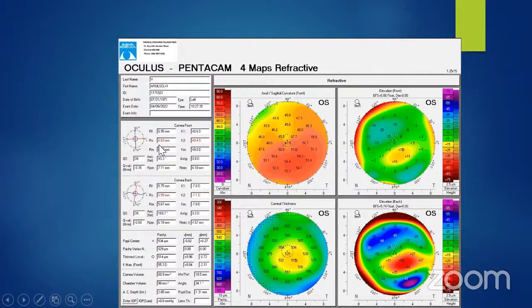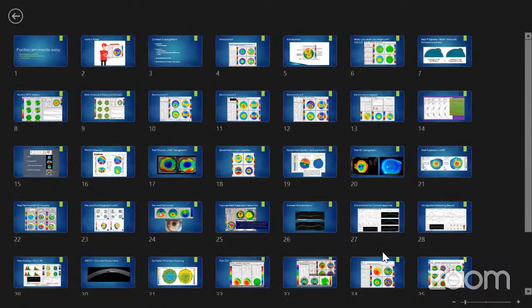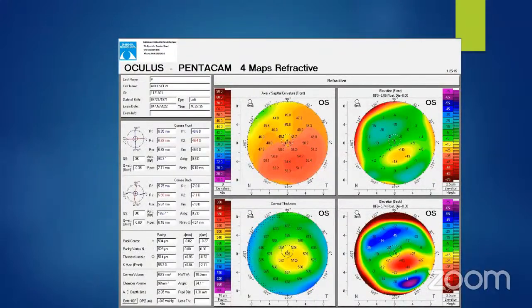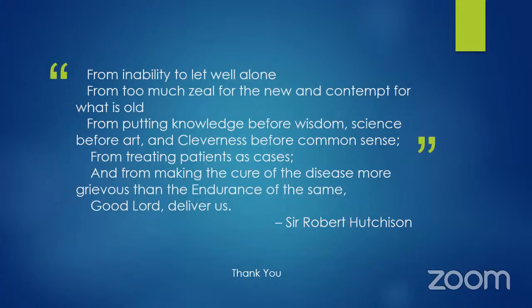Yes, ma'am. So before you jump to doing something, always understand that you need to see clinically and say that I would like to know what is the vision of the patient, and I would like to see whether this is progressing or not. Considering that it's 50, it may not be progressing, and if the patient is rehabilitated, we may not be doing something about this. Okay. So that is just to come back to the fact that nothing will replace a clinical examination.